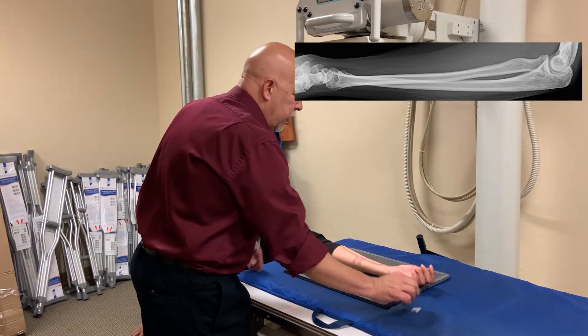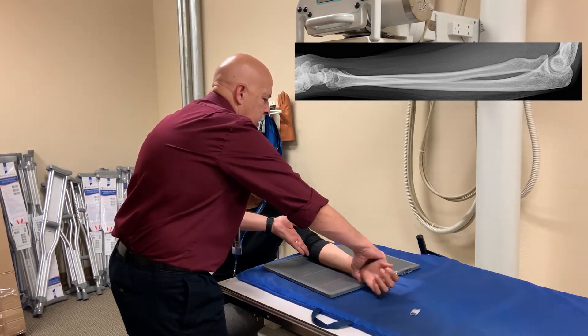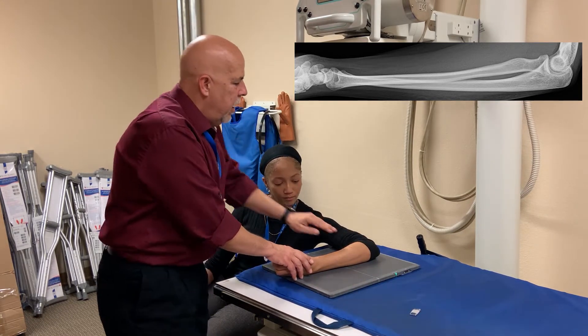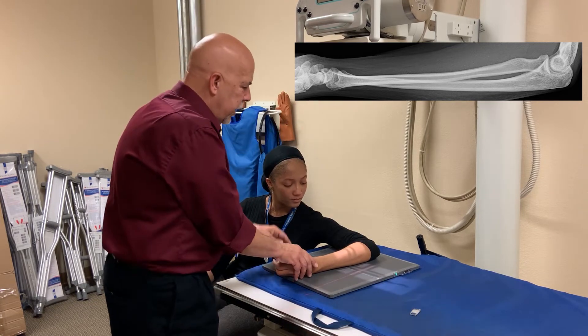For the lateral, we're going to do the same thing, except we're going to turn the cassette this way and bend her elbow, so that you have the shoulder, the elbow, and the wrist all in the same plane. Otherwise, you're going to angle the elbow joint, and you're not going to be able to see the joint appropriately.